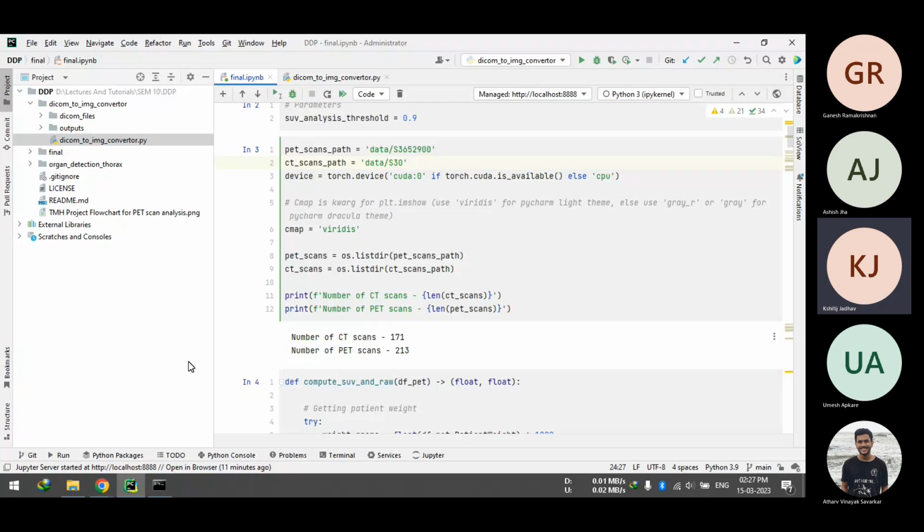Atharva, the question is back to you. What would happen if you don't segment it? You will basically require contours and bounding boxes for all the potential organs. Then you don't have to do segmentation at all, right? But still, I can't use the same organ detection code in abdomen as well as thorax. I will have to segment it, like differentiate it.